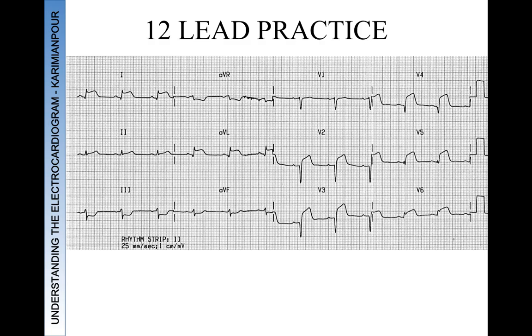So let's go ahead and do a practice 12-lead ECG. I'll give you a moment to pause the video and go through this. I want you to read the EKG and go through rhythm, rate, axis. There's an obvious finding on here, so it's okay to jump to that and say what it is, but also look for enlargements and hypertrophies, and your segments and intervals, if there is any prolongation anywhere. But remember, rhythm, rate, axis.